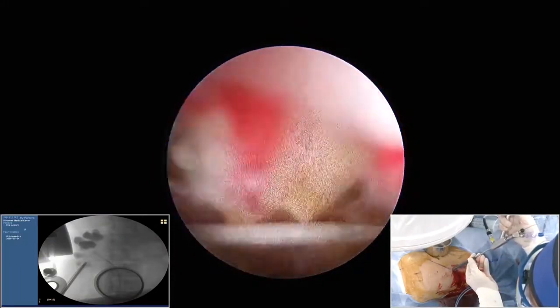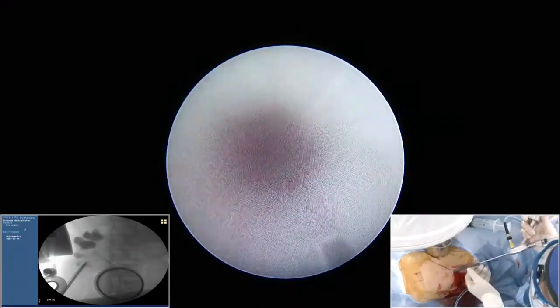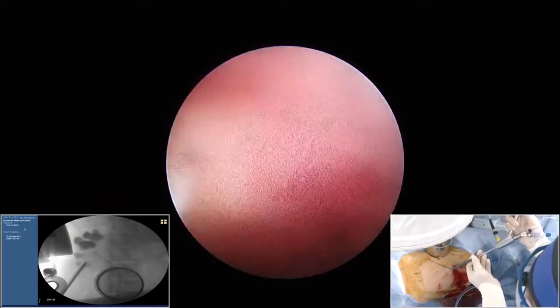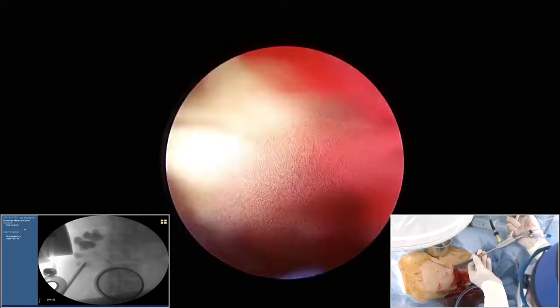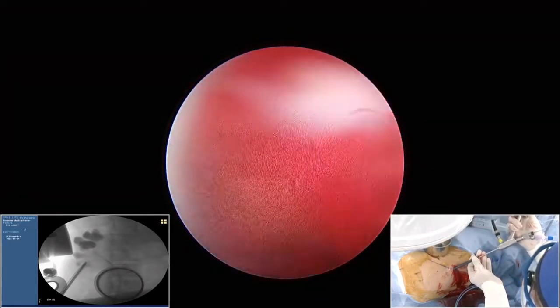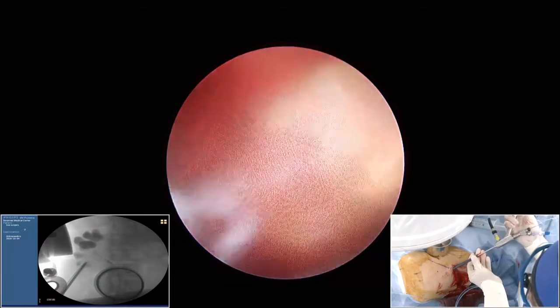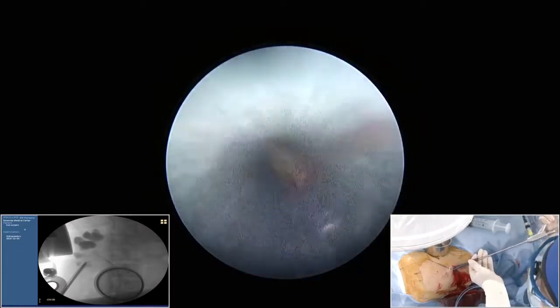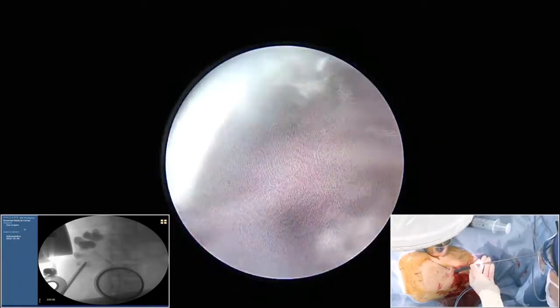Did you see, in the supine position, sometimes colleagues report that the system collapses because the outflow is too good? Have you seen this? This is a problem you would not see in prone position. If I use suction, the renal pelvis can collapse, but basically it doesn't collapse if we don't use suction. It's a matter of fluid management. So I don't feel any difficulty because of collapse of the renal pelvis, the renal collecting system.